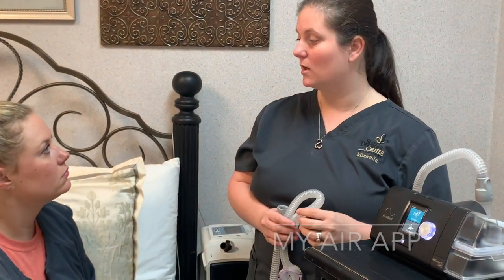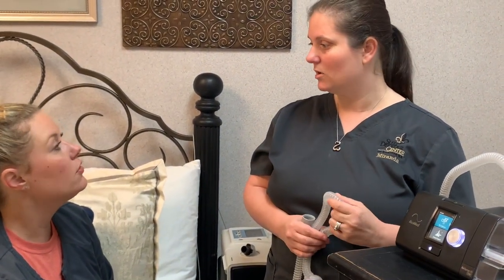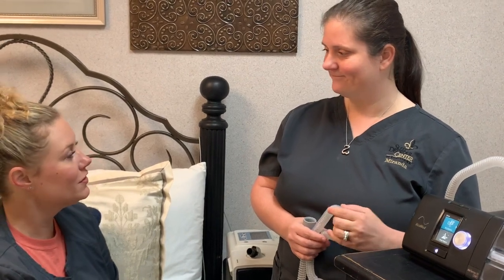The last thing — there is a little app called MyAir. There's a sticker on the top of the machine. You can download that app, Bluetooth your phone to your machine, and it'll send you a daily report just like it sends us. You can track your sleep too. Any questions? No ma'am. All right!